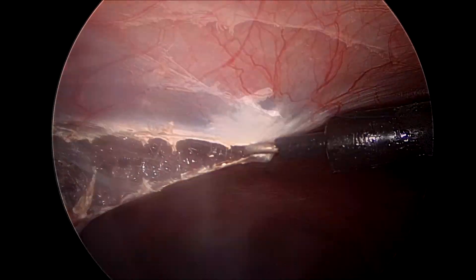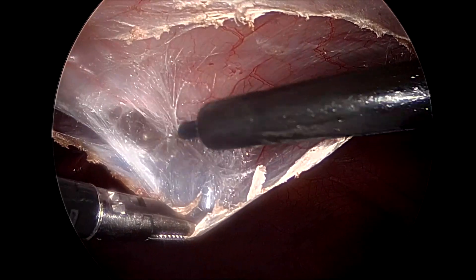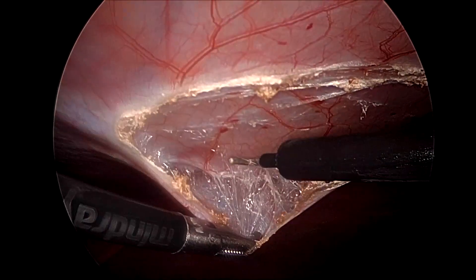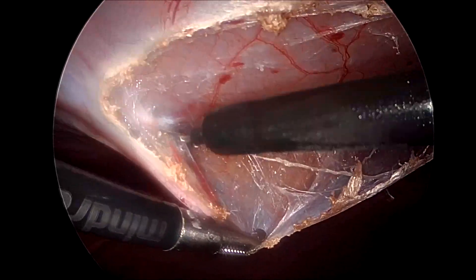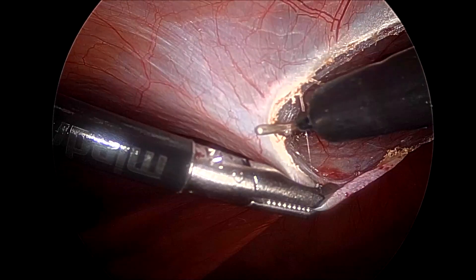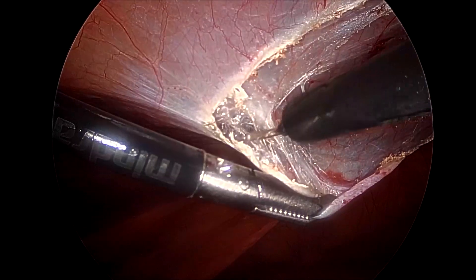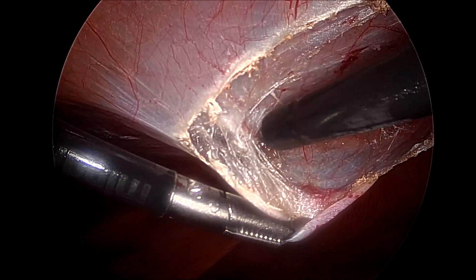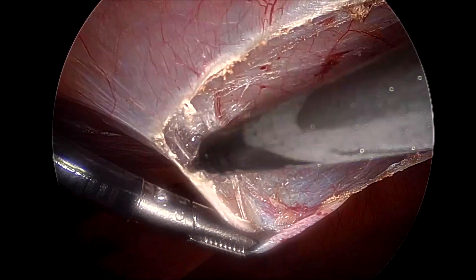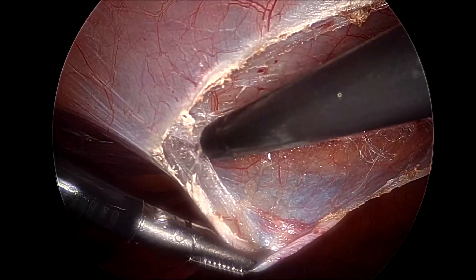This incision proceeds cranially first before progressing inferiorly. This is a minimally edited video at 2x speed to give a better perspective of the procedure and understanding. The initial part of the dissection is more challenging because away from the midline the peritoneum is thinner compared to the midline.